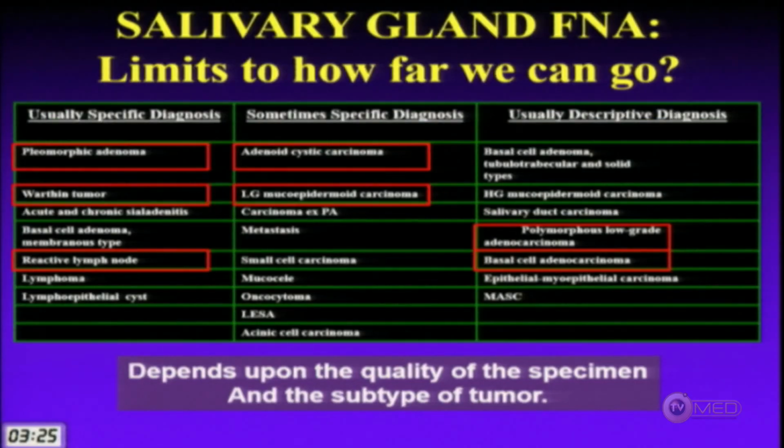So this chart, hopefully this PowerPoint will be available to you, is just something that I put together. When I get a salivary gland FNA, I look at it, and right from the get-go, I know that there are certain tumors where I can usually make a specific diagnosis, like pleomorphic adenoma and Warthin tumor. Others depend on the nature of the tumor as to how far I can go. So adenoid cystic and mucoep depend on the nature of the specimen, and ancillary studies, as to whether I'm going to be able to make a specific diagnosis or not. And then some tumors like the basaloid tumors, almost all the time from the get-go, I know I'm just going to put them into that uncertain malignant potential category.